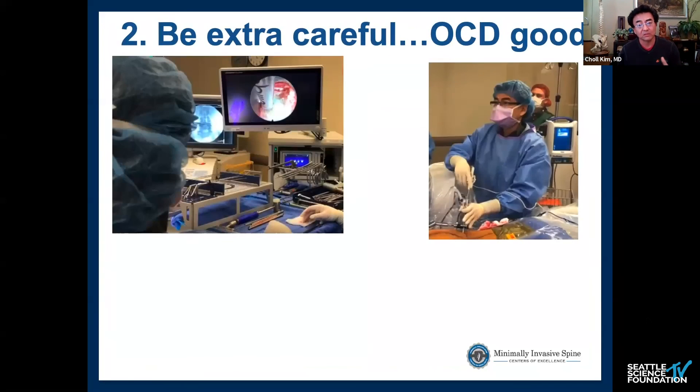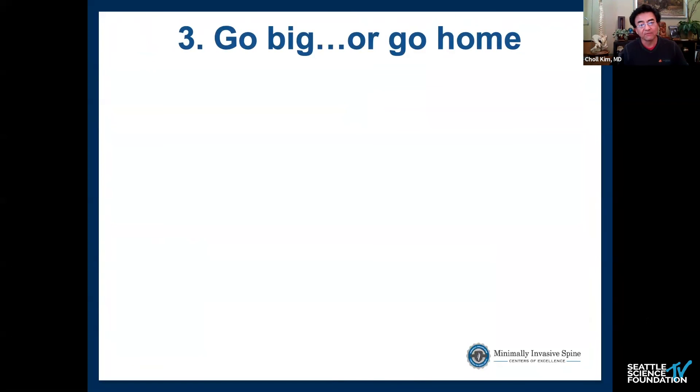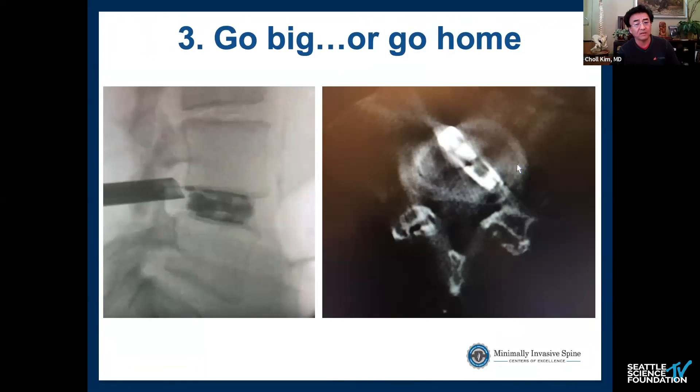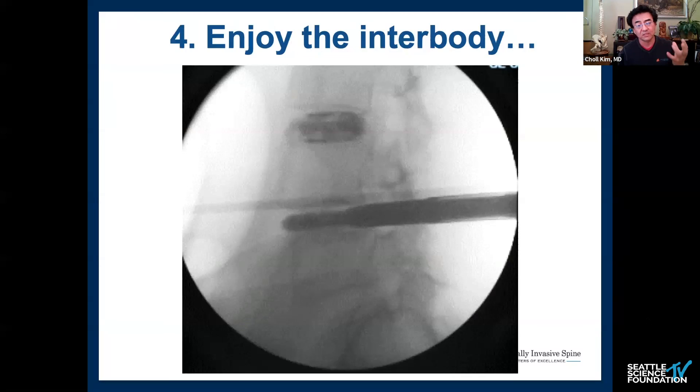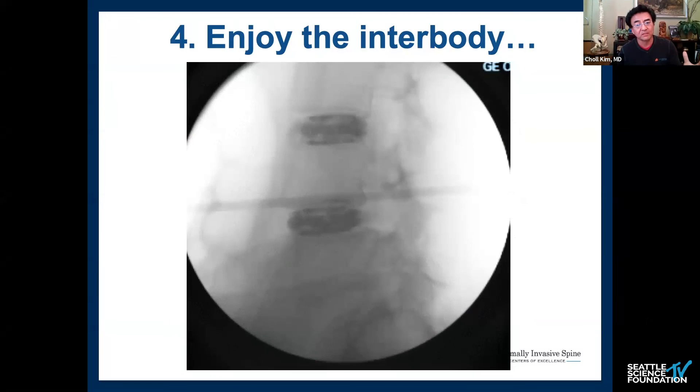To verify prep quality, bring the endoscope in and confirm thorough endplate preparation front to back — it's a narrow, long prep. I take a very oblique trajectory to place the longest cage possible, routinely using a 34mm cage, sometimes 30mm depending on patient size. The entry point is about 15 centimeters from the midline, while pedicle screws go in at four centimeters — so there are multiple separate incisions. Finally, use an expandable interbody spacer when the required height exceeds the posterior annulotomy window or cannula size — I call this the 'interbody erection,' and it makes a huge difference.